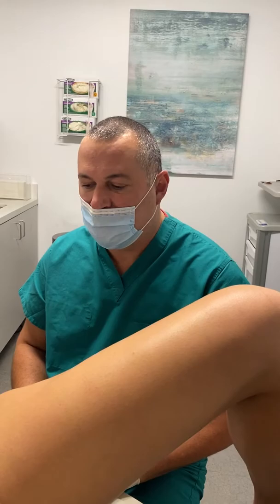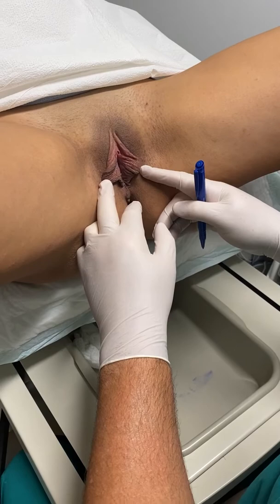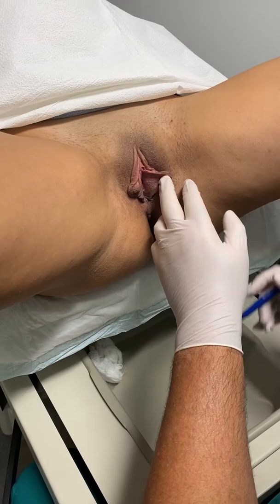So what I'm going to do today is show you my markings and then we'll take it from there. Even though there's nothing wrong with these labias whatsoever, if they do cause discomfort or cosmetically make you uncomfortable, we want to help our patients by empowering them. You can see the labias — I call these my wing labias, they look like wings — they protrude outside of the vulva, the labia majora, and they probably cause a lot of discomfort when wearing clothes or exercising, and maybe during intimacy as well.